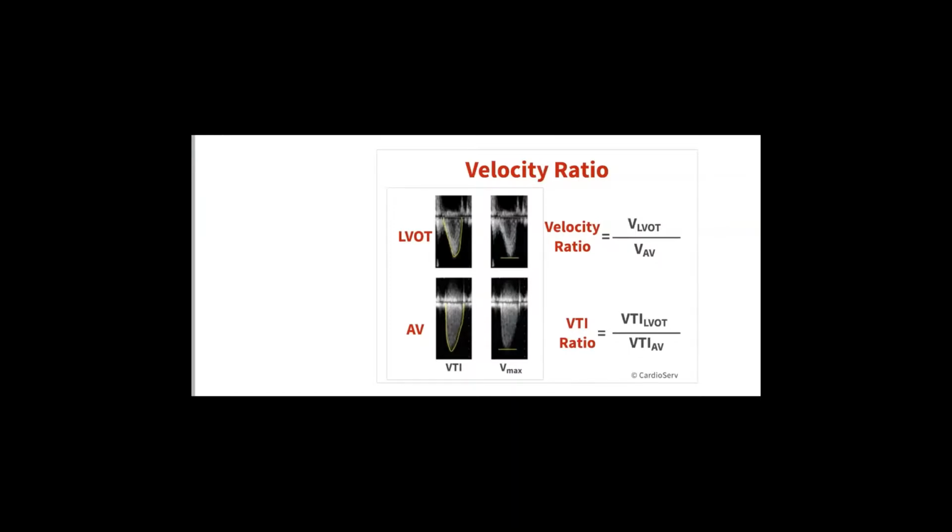If, for example, the patient has severe aortic stenosis but low flow because of low ejection fraction, I get stuck. I will not elicit a mean of more than 40. If I have severe aortic regurgitation, the mean gradient across the aortic valve might be high, though I don't have significant aortic stenosis.